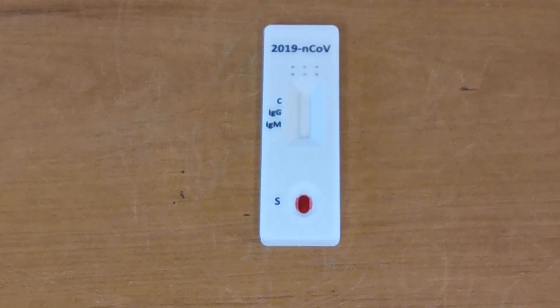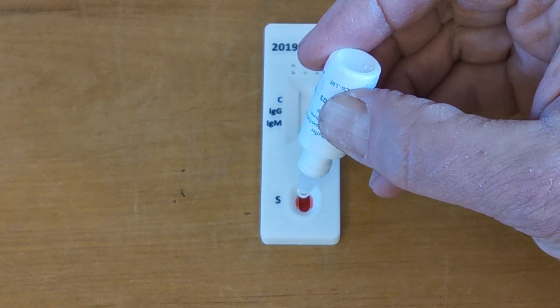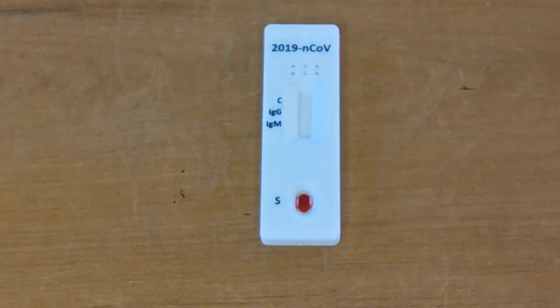So that is the technique for adding that, and then when the blood is in the sample well you apply two drops — one, two — of buffer, and that is the test starting.